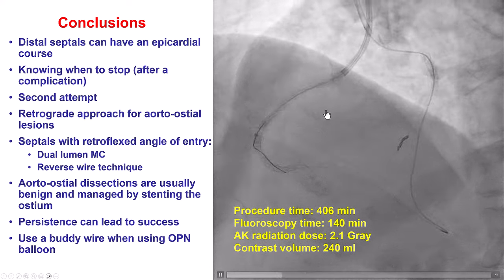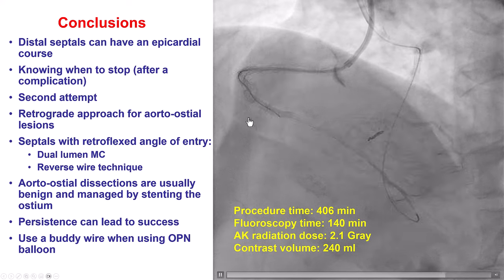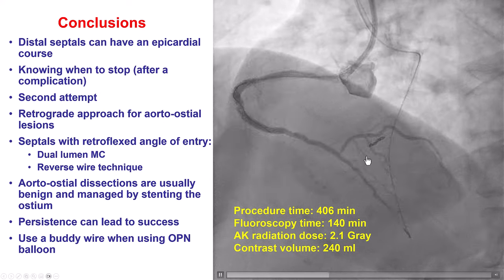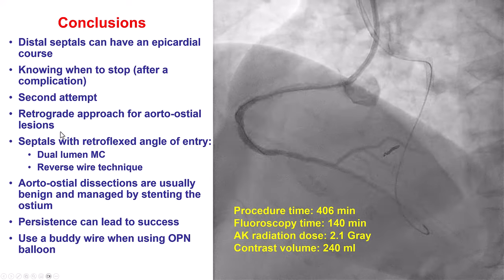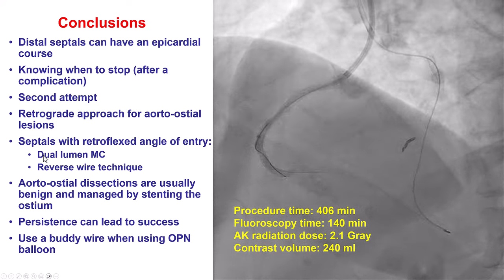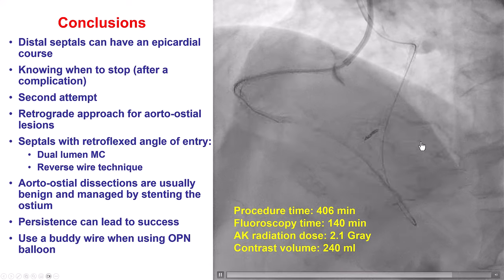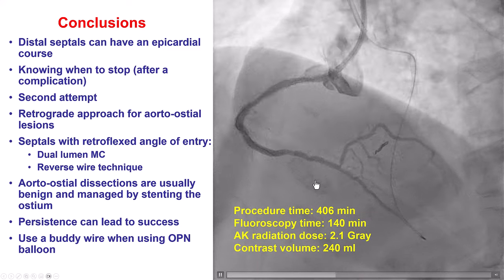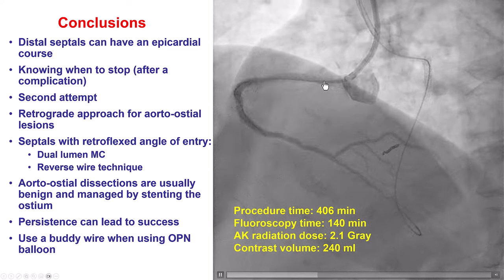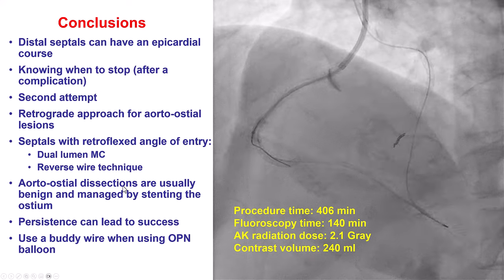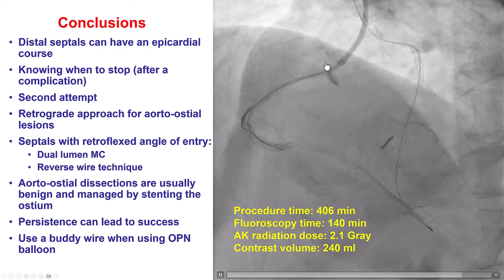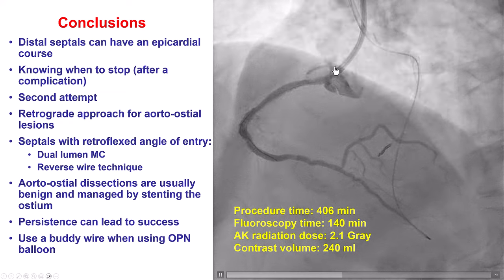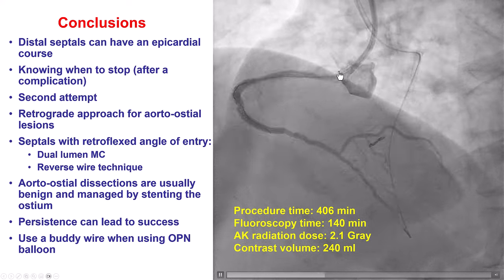In the second attempt, we knew we had difficulty advancing equipment antegrade — we tried again but failed. We also had difficulty entering the septal branch that was connecting. What helped was using a dual-lumen microcatheter and leaving a guide wire in the non-appropriate septal as a marker of where not to go. We had an aortocoronary dissection when we performed the retrograde Carlino technique; however, after stenting, this was covered and the smaller residual dissection will heal on its own. Dissections like this do not require any special treatment.